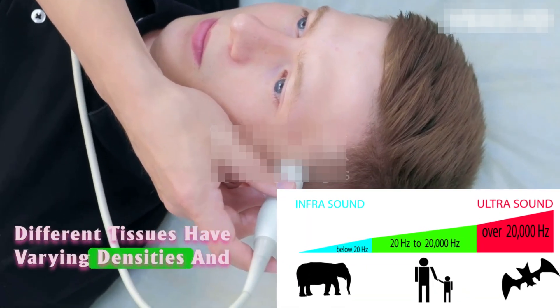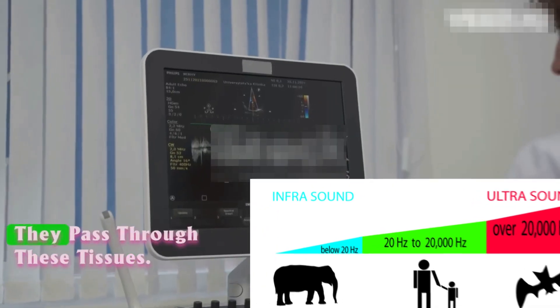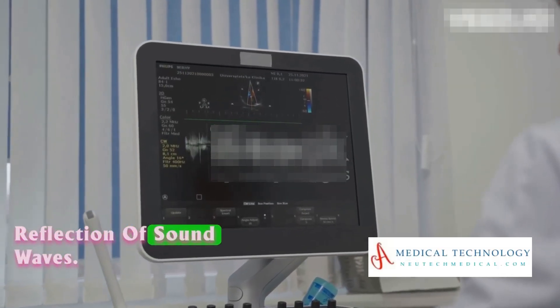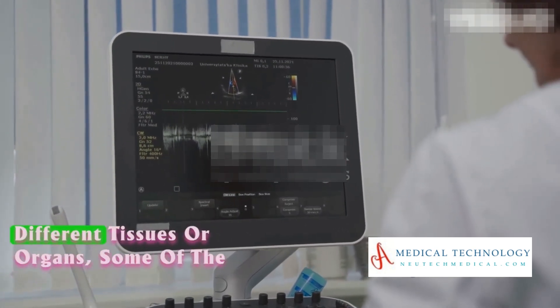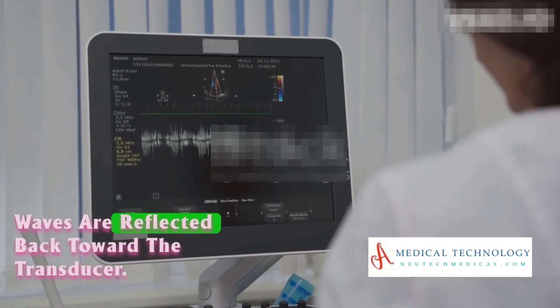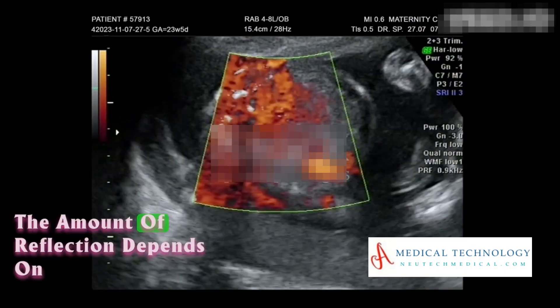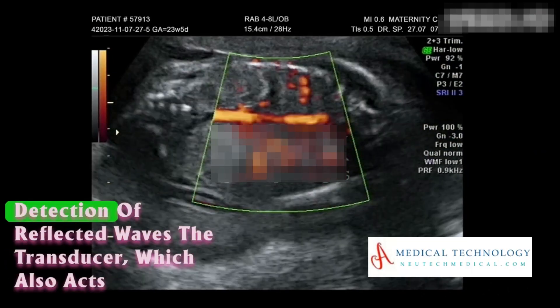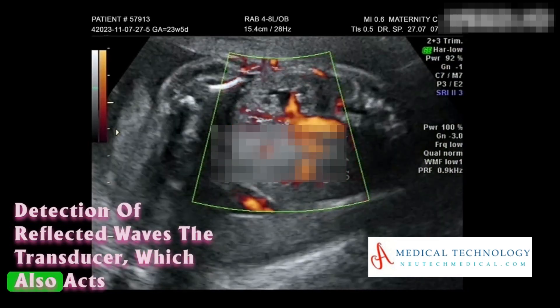Different tissues have varying densities, and the sound waves encounter resistance as they pass through these tissues. When the sound waves encounter boundaries between different tissues or organs, some of the waves are reflected back toward the transducer. The amount of reflection depends on the density of the tissues.